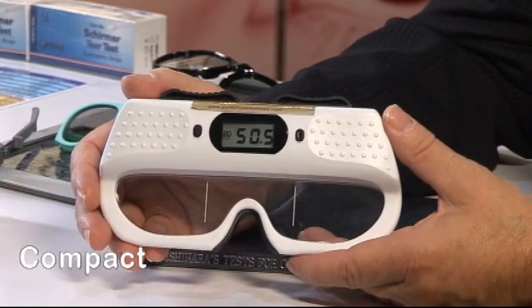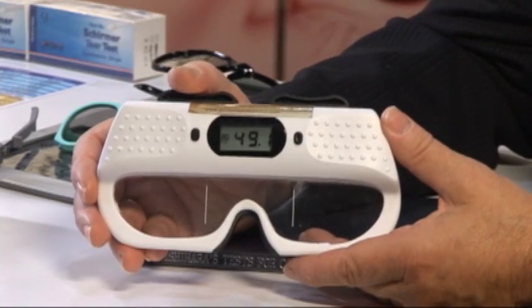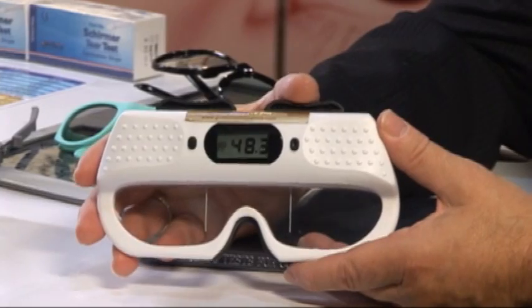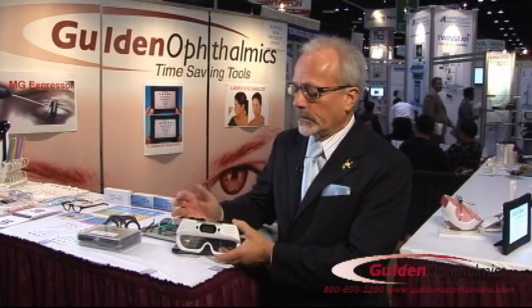This is our new digital PD ruler. It's very compact and portable. Basically all you need to do is set your right eye, set your left eye, and then this gives you the distance between the two eyes.